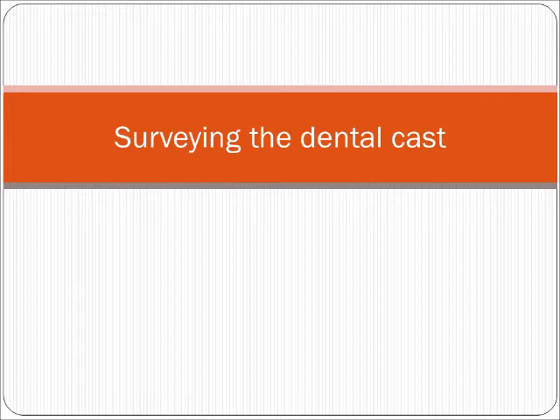Surveying the dental cast is an important preliminary procedure used in the diagnosis and treatment planning of the removable partial denture. In this video we will demonstrate and discuss the armamentarium, rationale, and procedure for surveying.